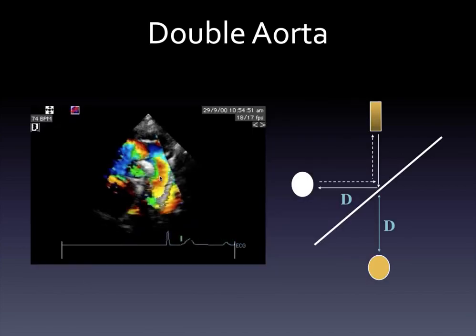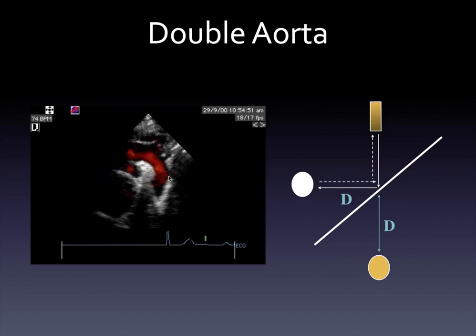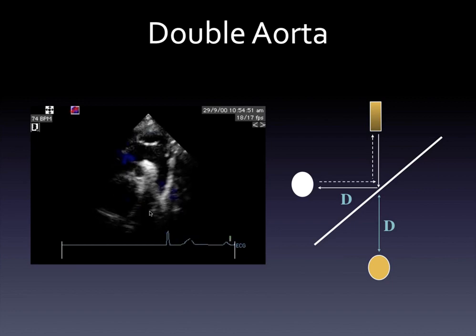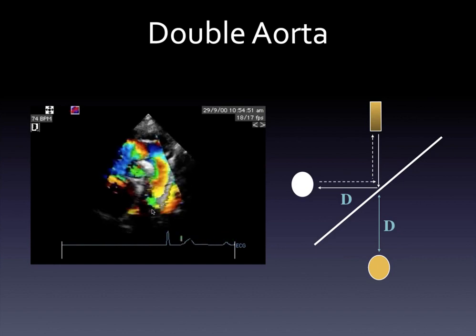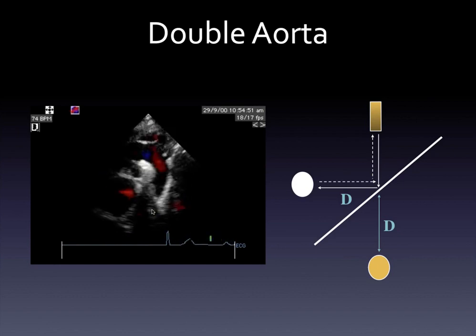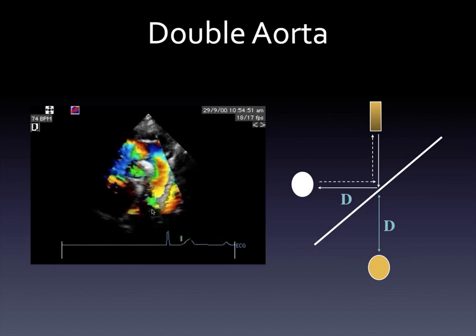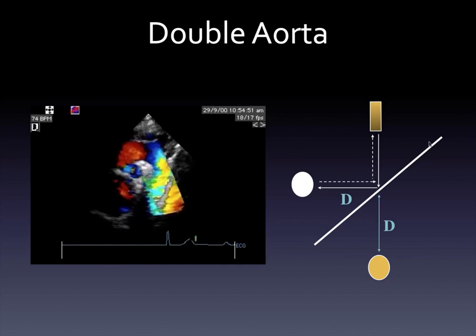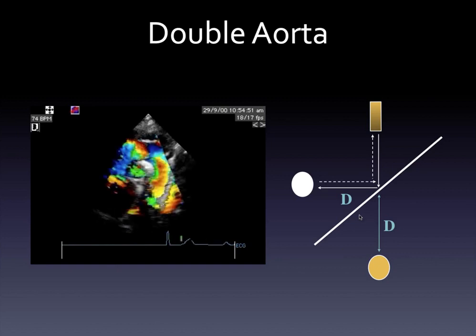So here is actually how it works. This is the far field of the aorta, which is a specular surface, and it acts like a mirror. A specular surface is defined as when the particles are very tight together, so everything that comes in is a strong reflecting beam that goes back rather than getting scattered all around. So here is the equivalent of the side wall or the far wall of the descending aorta, which acts as the reflector, like a mirror.